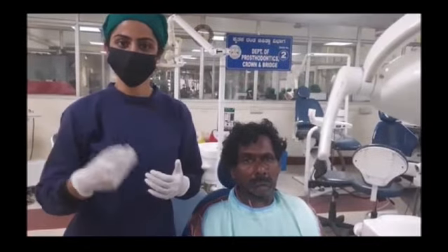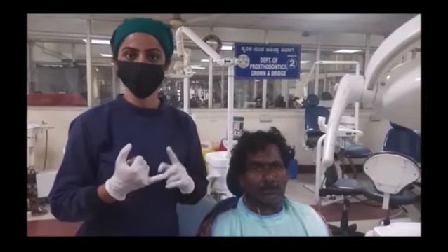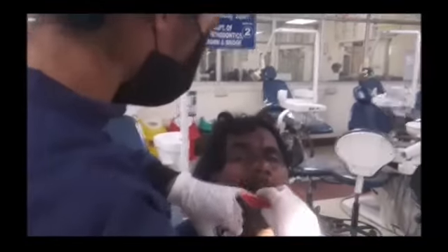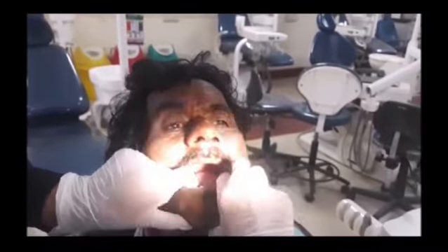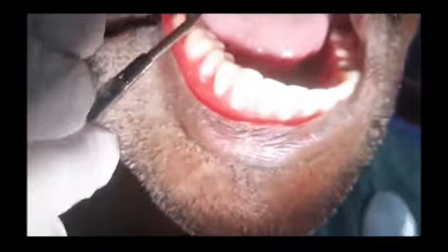Mandibular trial denture. The mandibular denture is first evaluated individually for the following: peripheral extension, stability, tongue space, height of the occlusal plane. First, the lower denture has to be placed into the patient's mouth. Then the labial and the buccal borders are evaluated by moving the cheeks and lips inwards and downwards for the chewing movements. Then the lingual extension can be evaluated by protruding the tongue to moisten the lips.